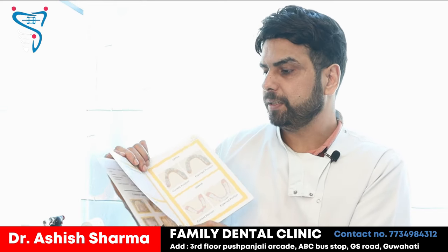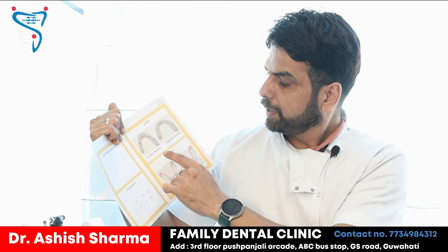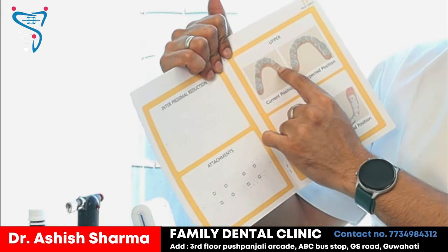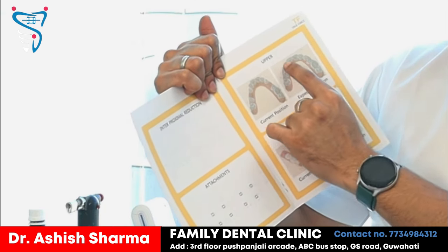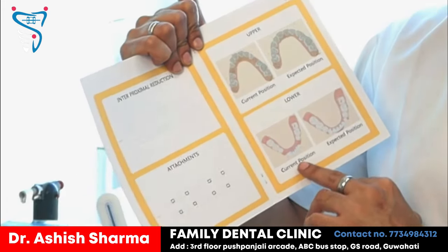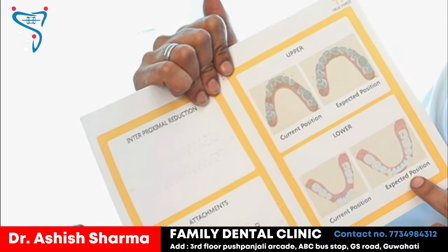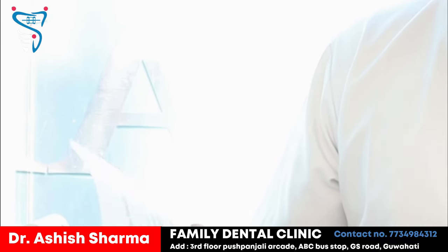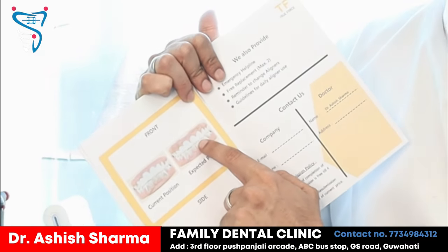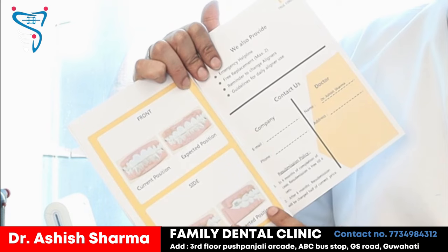On the next page, where the attachments are to be placed, a photo has been given. This shows the current position after extraction — the gap because the tooth is removed — and this is the expected position, also shown as a photo. This is done by their software. Then again, the current position and the expected position are shown from the front — how it will start and how it will end — and also from the side, how it will start and how it will end.